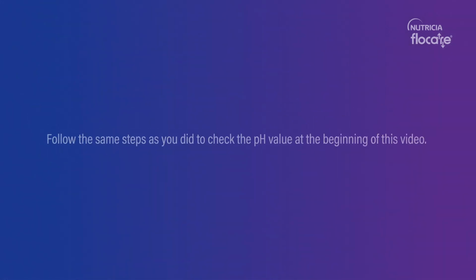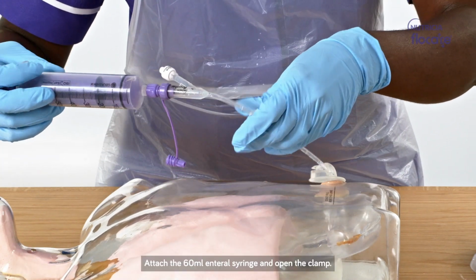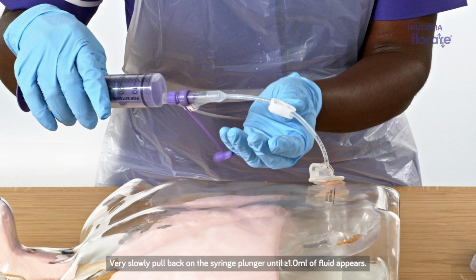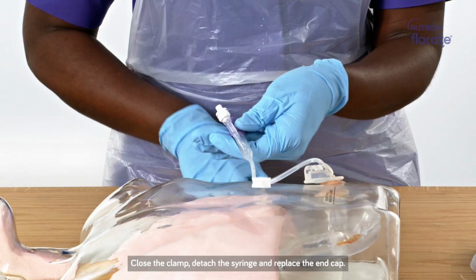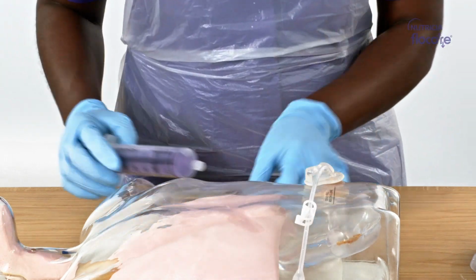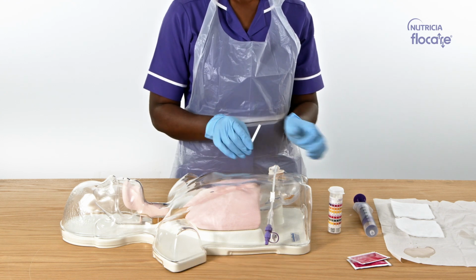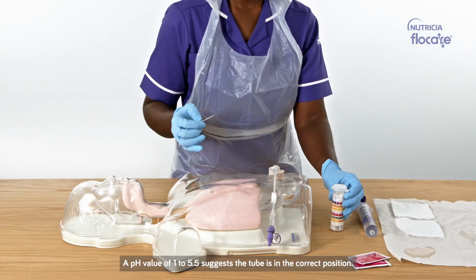Checking the position. Follow the same steps as you did to check the pH value at the beginning of this video. Check the clamp is closed before removing the end cap. Attach the 60 ml enteral syringe and open the clamp. Very slowly pull back on the syringe plunger until greater than 1 ml of fluid appears. Close the clamp, detach the syringe, and replace the end cap. Drop the fluid onto a pH indicator strip. A pH value of 1 to 5.5 suggests the tube is in the correct position.